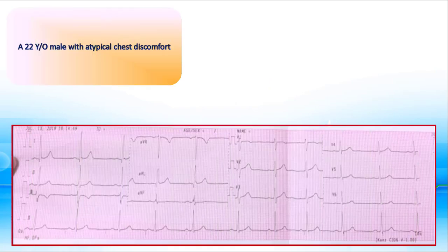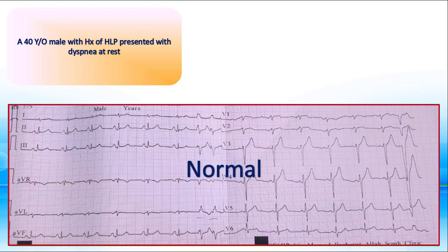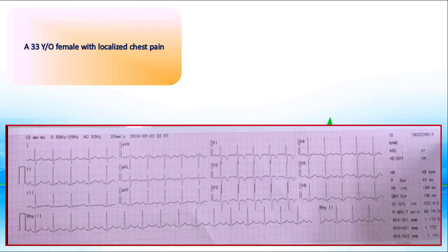Here is an EKG from a 22-year-old male with atypical chest discomfort. There is an isolated shallow T inversion in D3, which is considered normal. The next EKG belongs to a 40-year-old male with a history of hyperlipidemia presenting with dyspnea at rest. There are upright T waves in all leads except V1, AVL, and AVR — therefore this is normal. Remember that isolated T inversion in D3 and AVL is a normal finding.